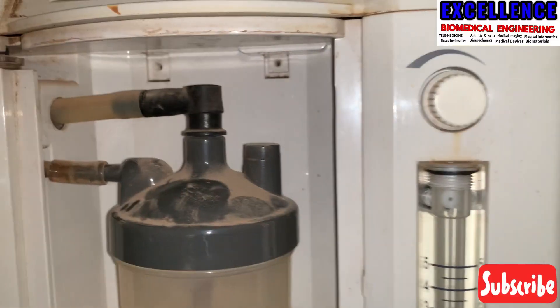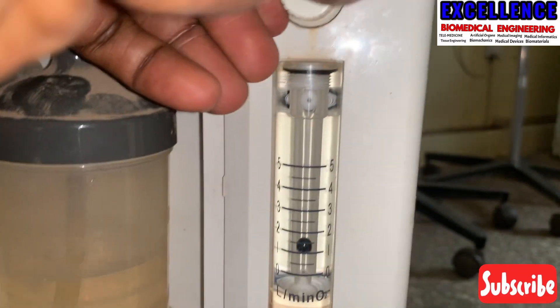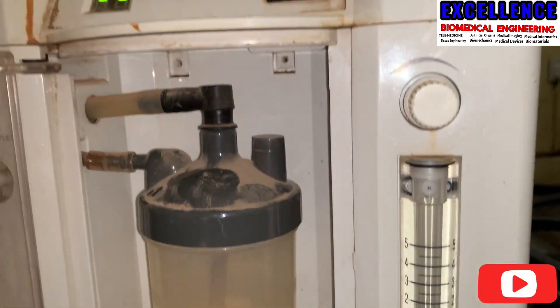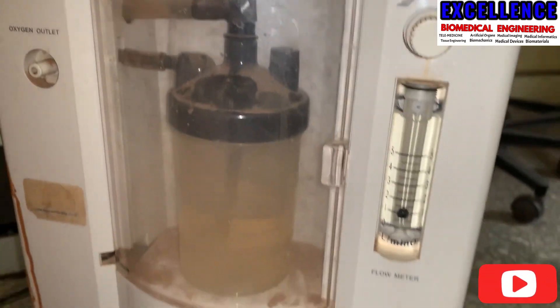As you can see from here, we've detected that there is somewhere where the tubing is broken, and that is why there is not enough oxygen being supplied to the oxygen flow meter. So this is just what you have to do — check the tubing if there is a blockage or any breakage along the line.